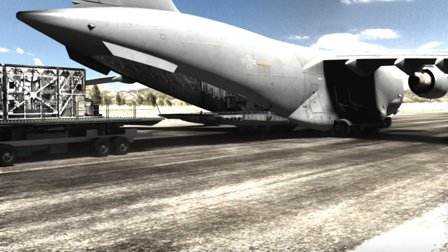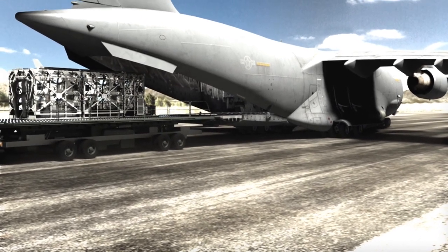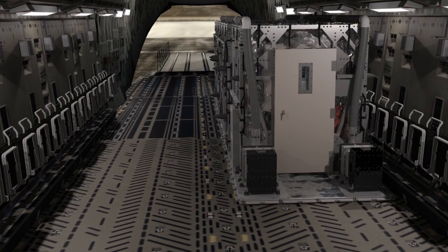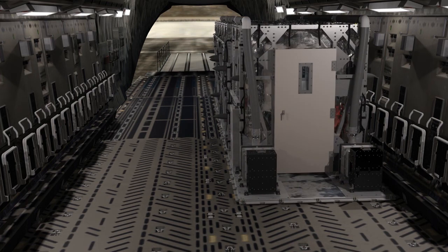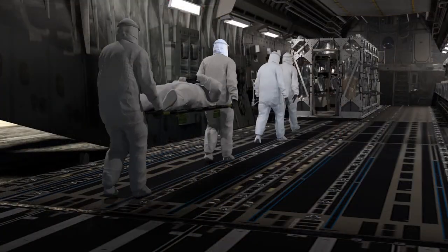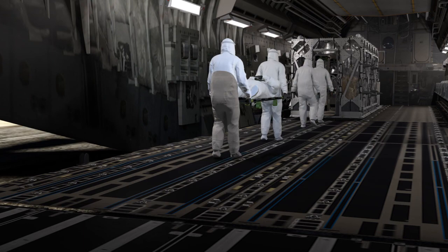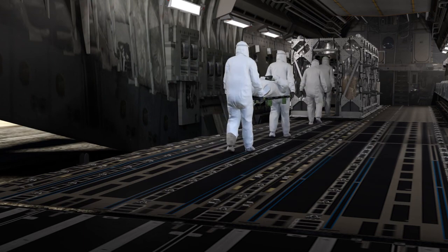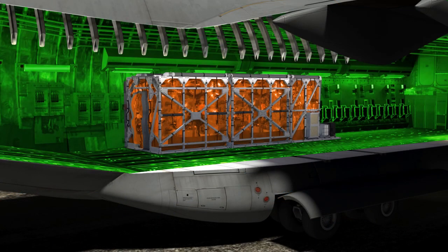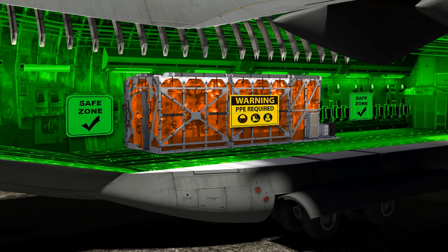The TIS can be loaded onto a C-17 or C-130 aircraft by standard K-loaders after the modules have been assembled and connected. Patients are loaded into the TIS through the aft door of the isolation module by medical personnel. The TIS provides medical personnel the ability to care for and treat patients in flight without risk of contamination to the rest of the aircraft.